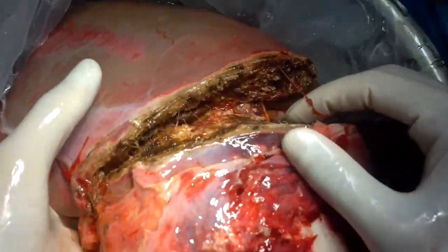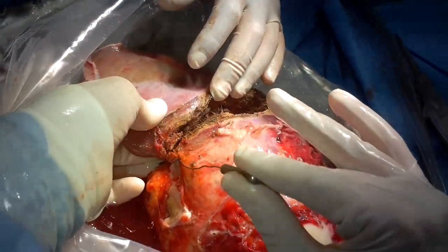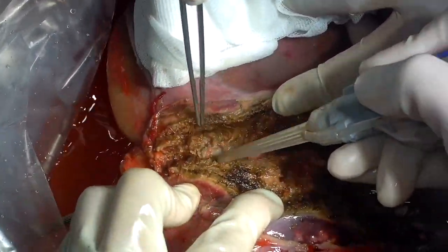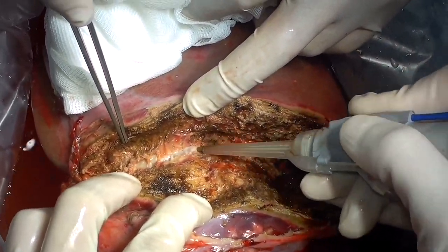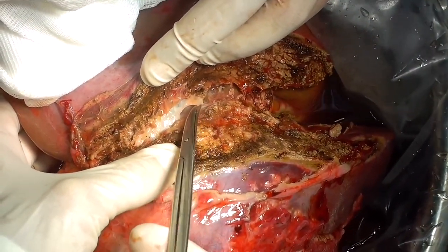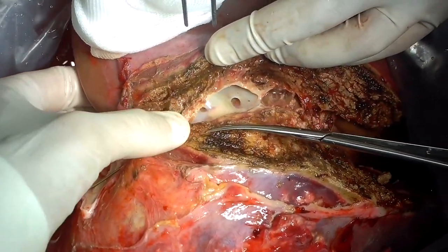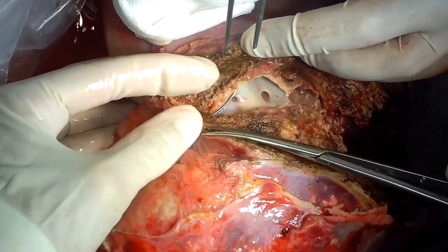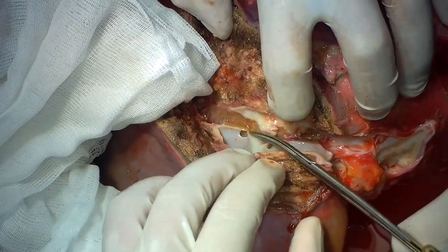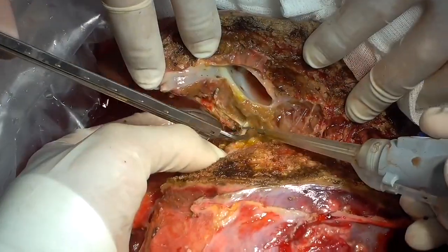After this, we commence with the back table stage. We carefully examine the liver in the resection area and determine the course of the left hepatic vein. We expose its wall with a scissor and then open up the vein, leaving the wall fixed to the lesion on the affected side. Now we can continue the parenchymal division. Small vessels are cut between clips.